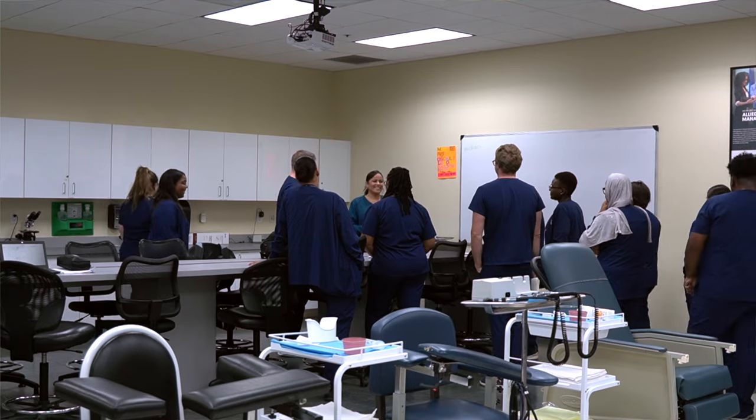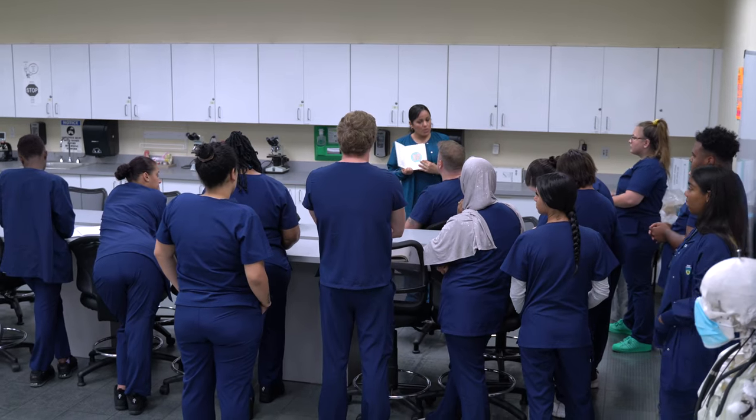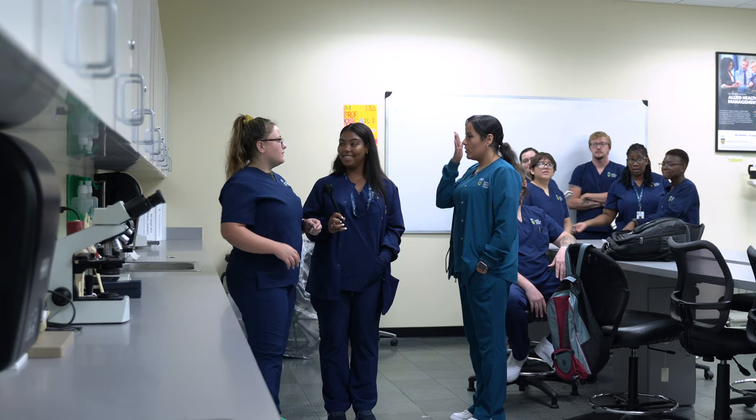We will be practicing eye installation and irrigation. Eye exams are done usually in a complete physical setting for annual exams. However, eye installation and irrigation may also be done in a family practice office.